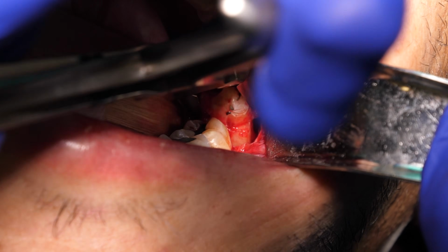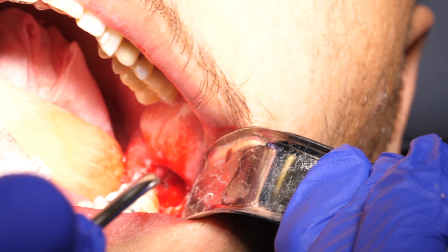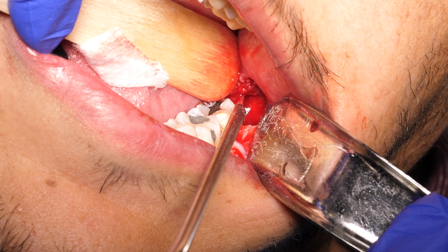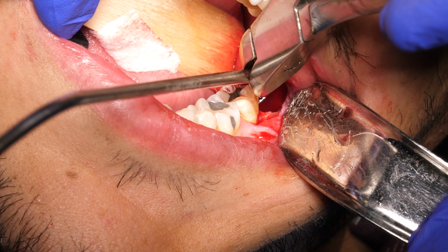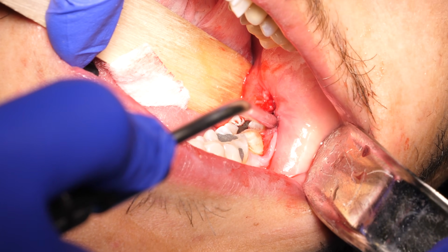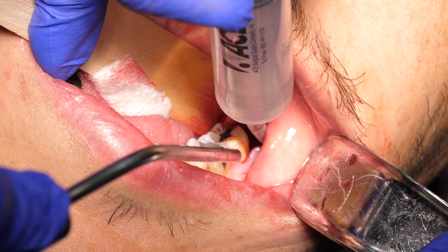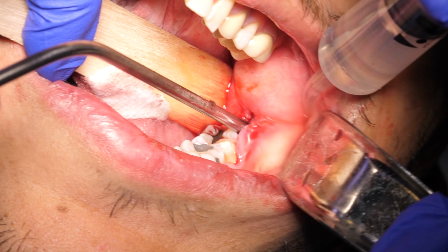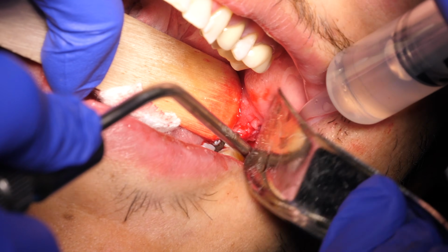After the tooth is removed, inspect the socket to ensure no remnants of tooth are left behind. Curettage of the site is done to remove any granulation tissue and dental follicle associated with the impacted third molar. It is imperative at this stage to irrigate the site thoroughly with sterile normal saline, especially underneath the periosteum buccally, to prevent subperiosteal infection.